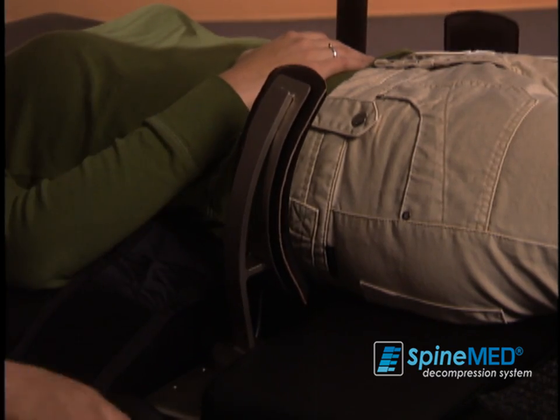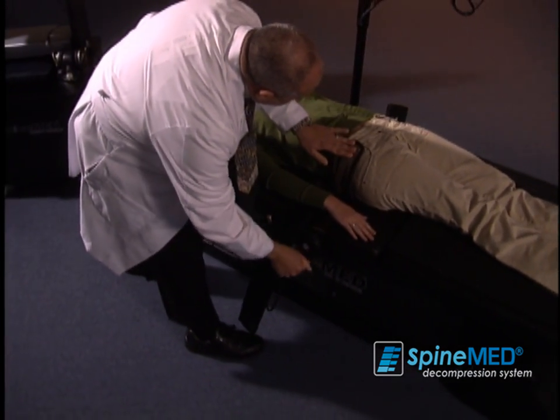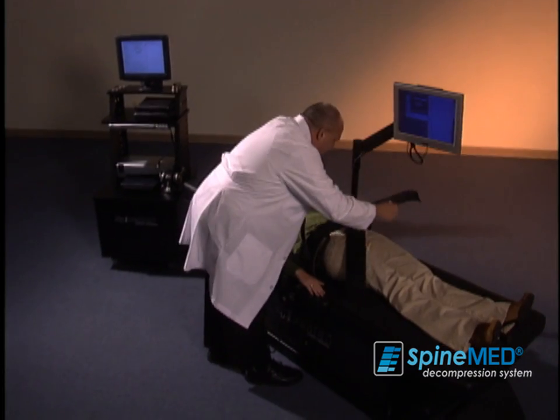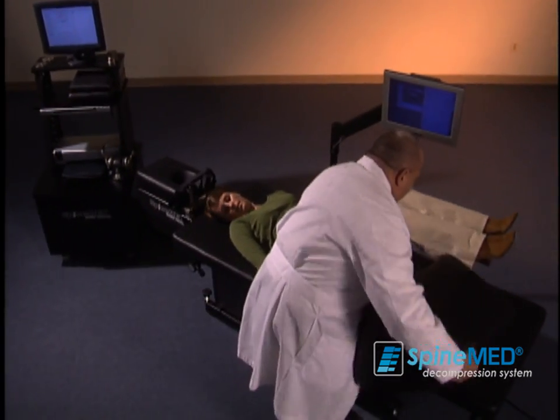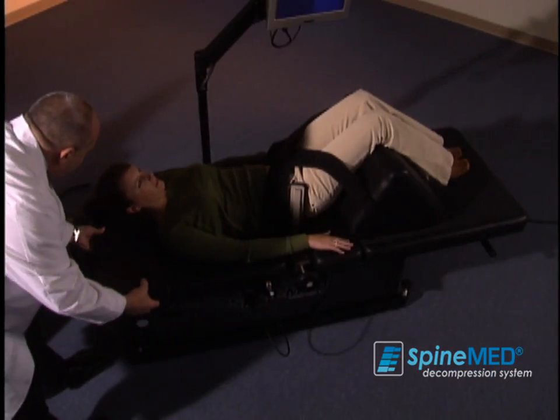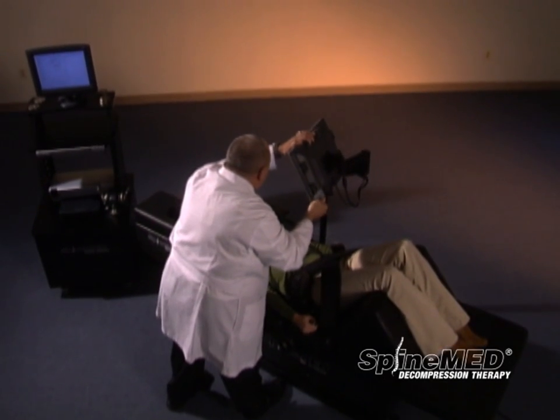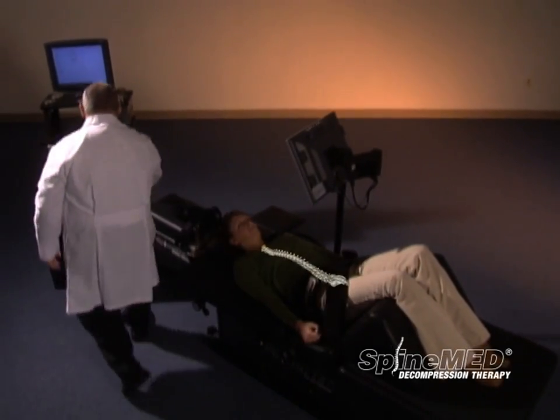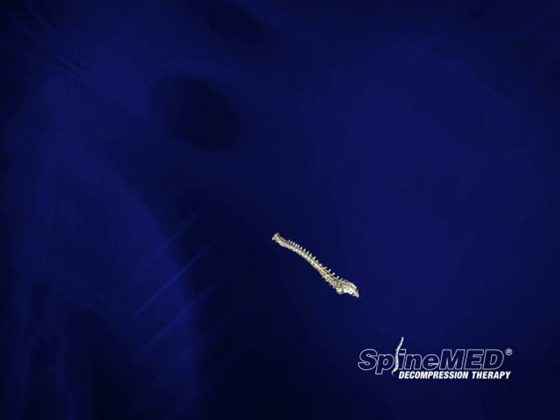or neck pain that can cause numbness or tingling in the arms and hands. Once we have identified the most common causes and conditions leading to back and neck pain, you will learn how SpineMed decompression therapy is designed to alleviate the underlying problems, relieving pain, and helping you return to the activities you enjoy, all without the use of drugs or surgery.